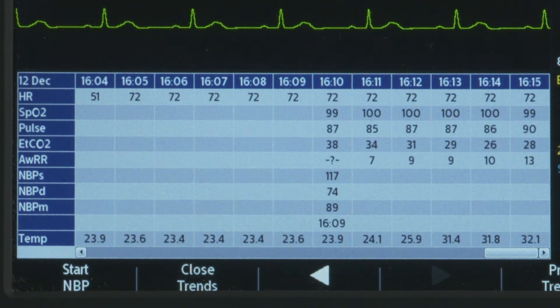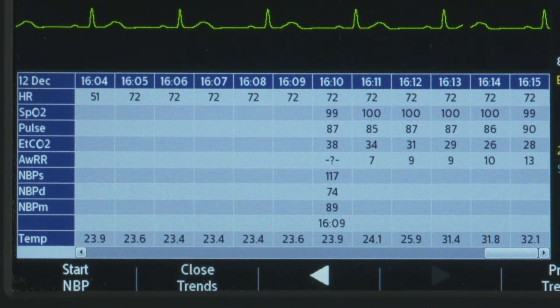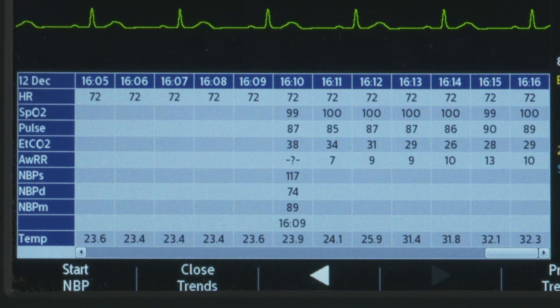Most recent data is to the right and older data to the left. As new data is acquired, it displays on screen.